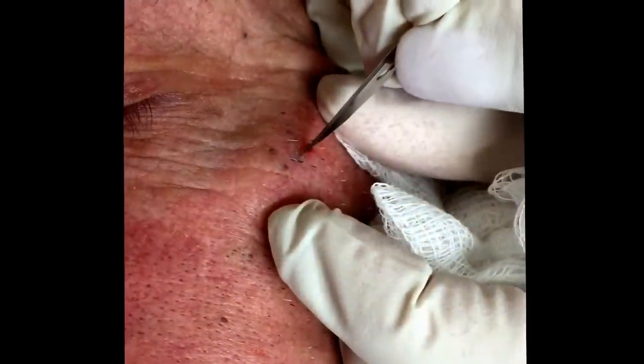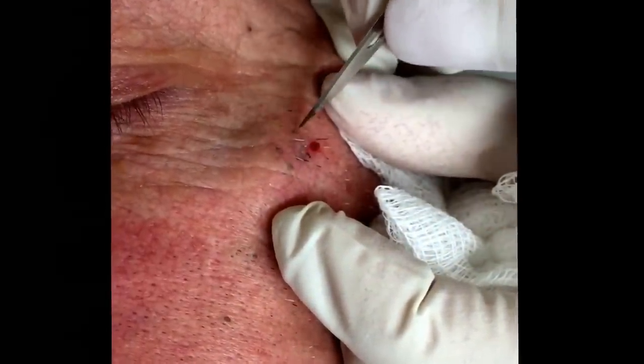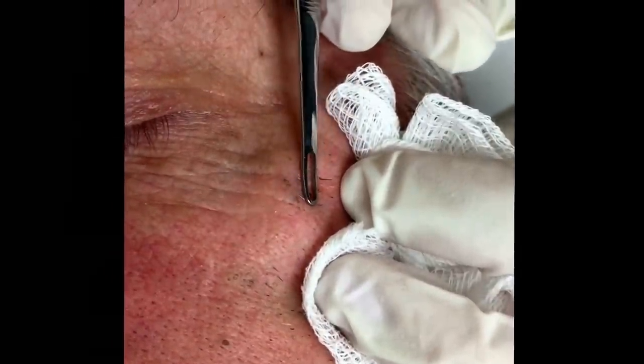I'm just going to put a little nick in the skin so I can get to these. You okay? He doesn't — he kind of doesn't like any of this stuff, I have a feeling. He's not going to like me pushing on him here. I'm fine.